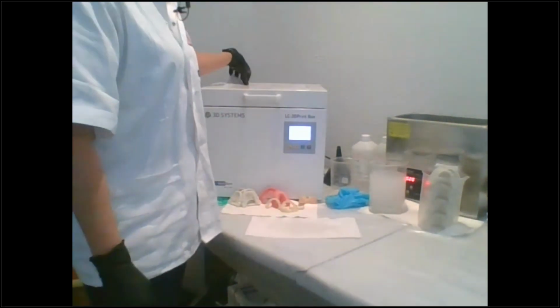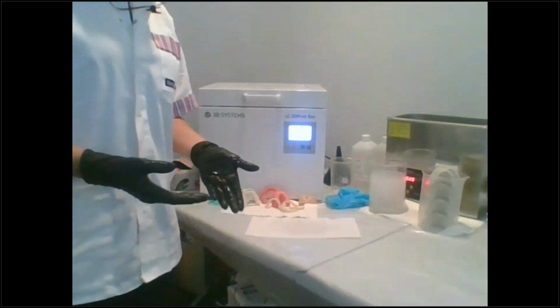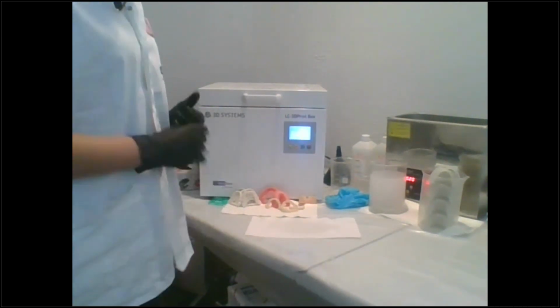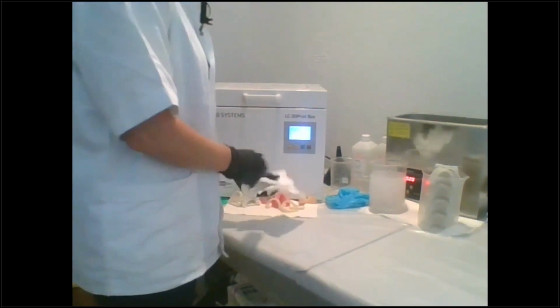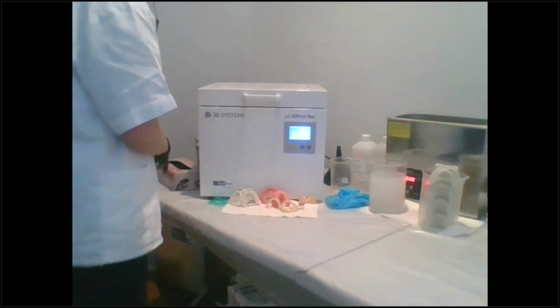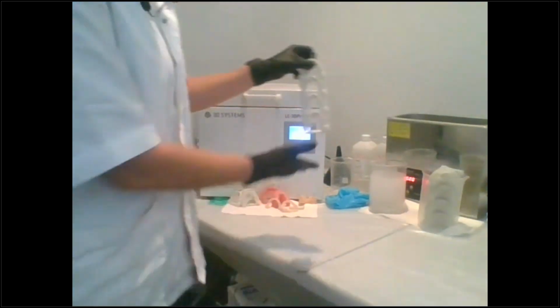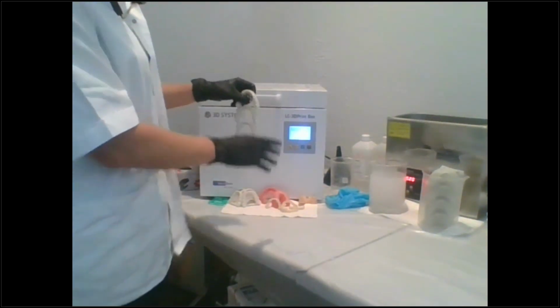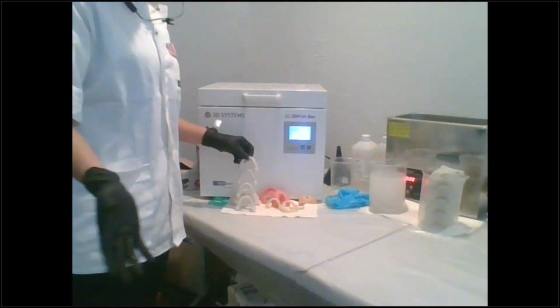You can see your cure oven chart. And for models, it's 10 minutes. I have some photos for you on the remainder of the PowerPoint to show you the different scenarios and the ways that you can set them up in your oven. But there's little feet on the bottom of the stack. You can set them right in your oven, standing up, and you can fit several builds in there.